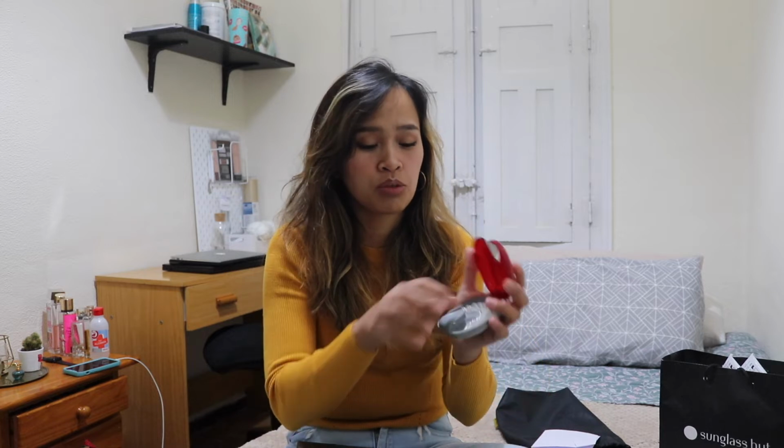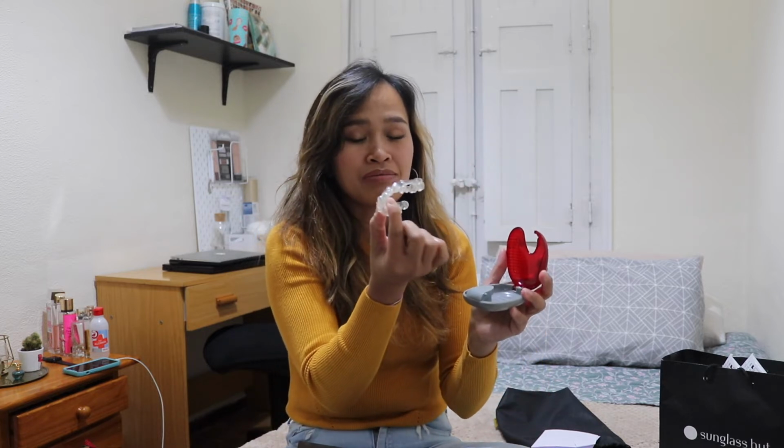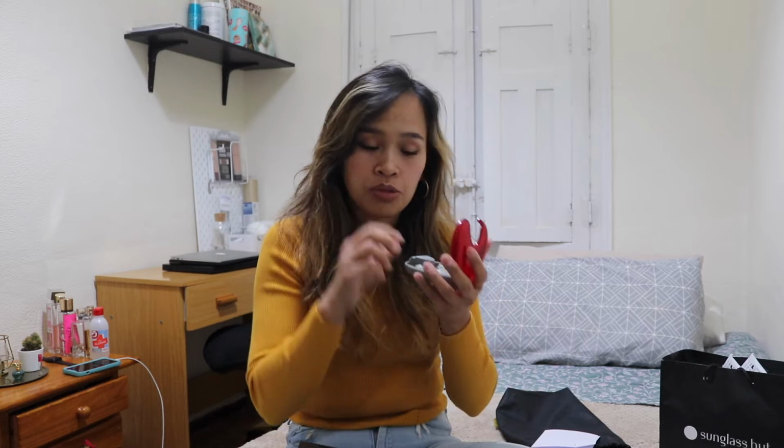This is where you put your liners, so they won't get lost. It's very important that every time you don't use them, you put them inside, because they're clear and you don't want to lose your liners, okay? So you always have to put them inside and close it, and when you want to use them again, just put them back in your teeth.